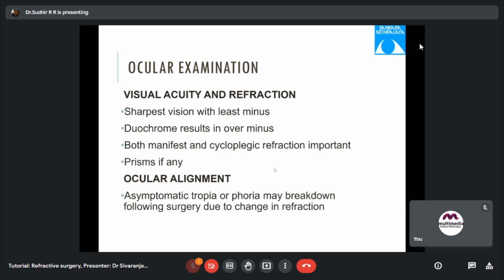You don't have control because the patient has to focus at a distant object when they are measuring auto-ref. Unfortunately, everything is closed. Okay. So when they focus, they may be using some accommodation and all that. So that's the reason you should always look at retinoscopy, because with retinoscopy the patient is always focused at a distant object and then you take the value. So the objective and subjective refraction should match. If there is too much of a difference, that means the patient is using some accommodation. So it needs to be taken care of.